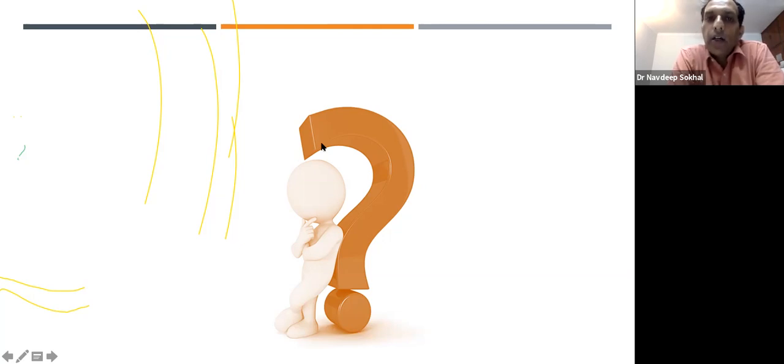And when the signal quality is poor, it means the recording from the electrodes is either not properly gathered or the electrodes are not properly attached. There's interference with the gathering, there's resistance, impedance. So the values are very low, and these are not reliable values.